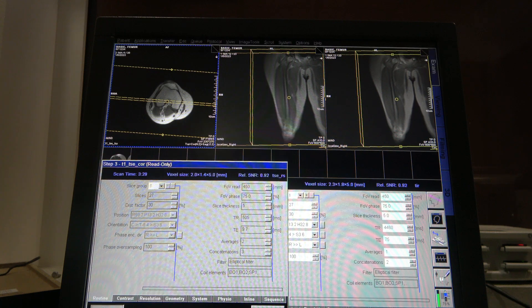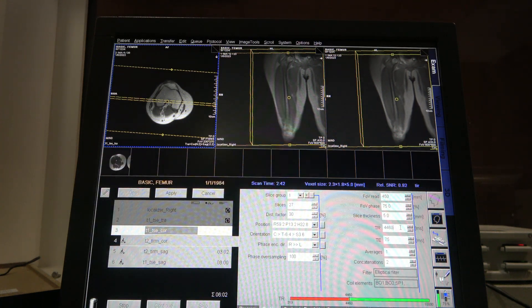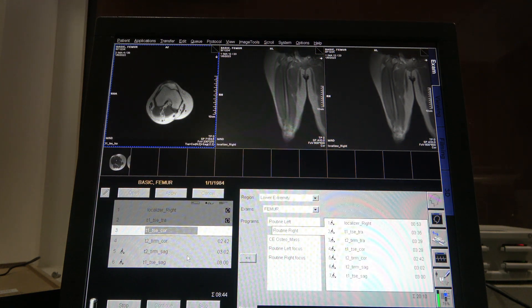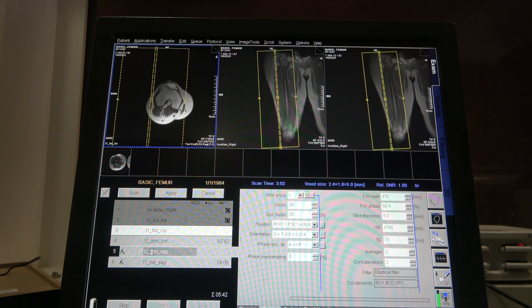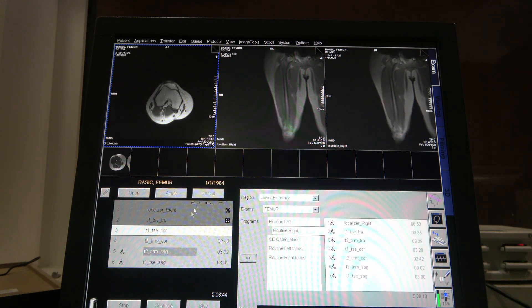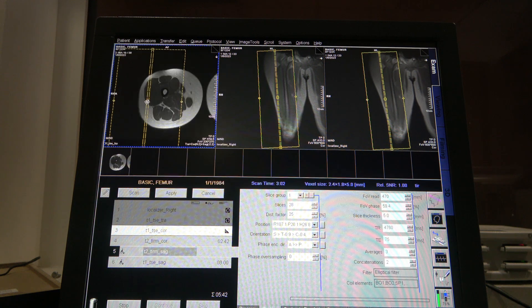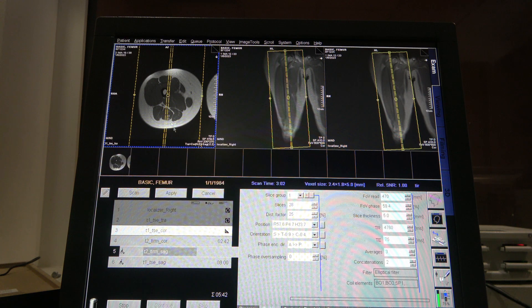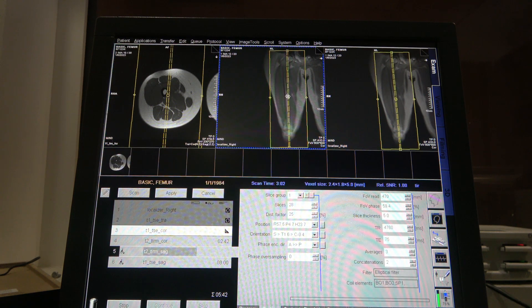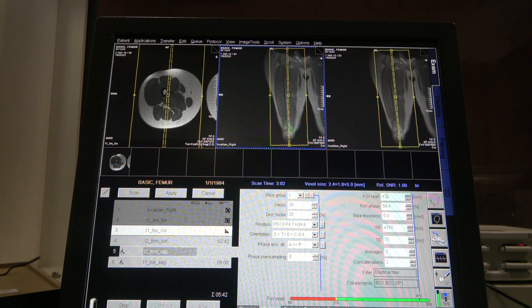All right, close. Let's check the TR. And apply. Now let's set up for a sagittal. You can double-click and it opens a tab, or you can just highlight it and hit Open, or just wait until this coronal starts and then it'll open up. Since we have an axial here, that will help us set up. Now, most likely when you change the field of view on a coronal, you can get away with changing it with a sagittal and vice versa. So we're going to move this to 450.